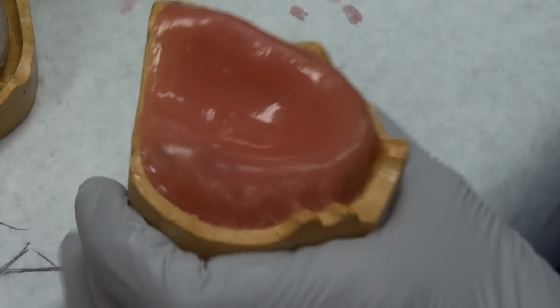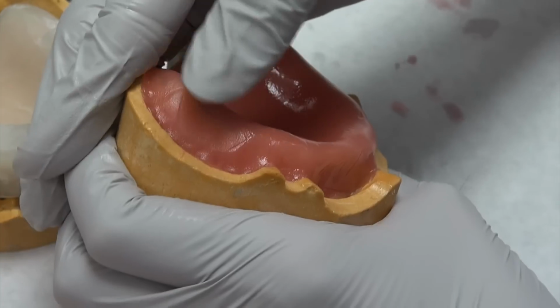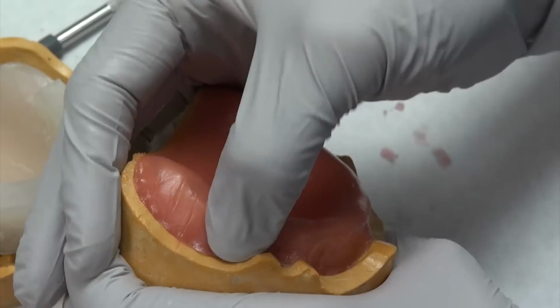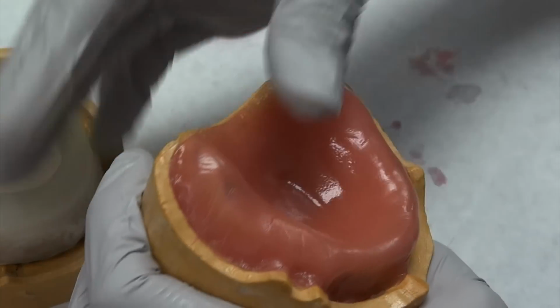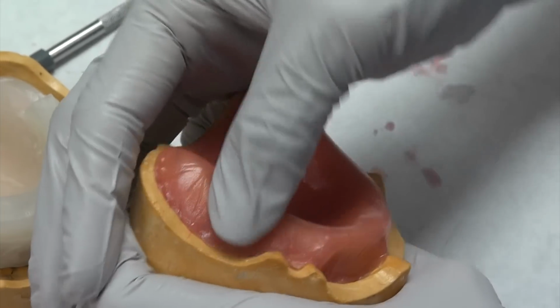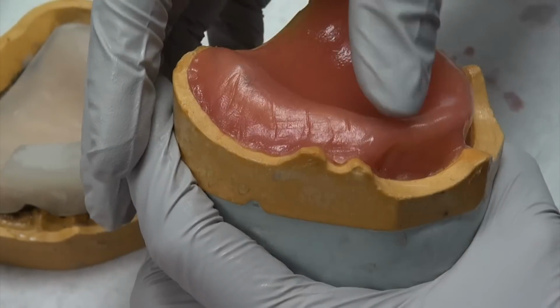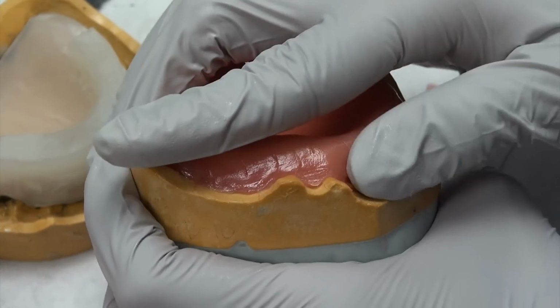How are you going to do that? Well, you're going to simultaneously fill the vestibules by pushing down. So significantly more pressure than what you were using on the palate, as well as more pressure than you were using previously. Okay, so see how it's already going over? So that's why you want to be a little short.